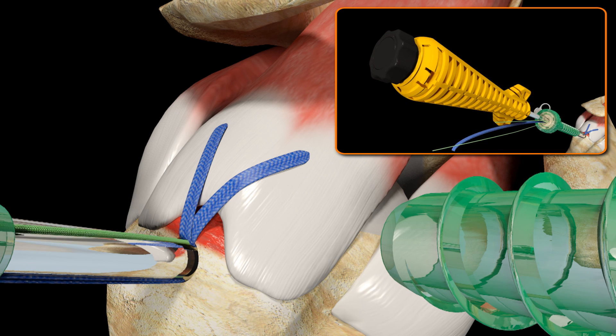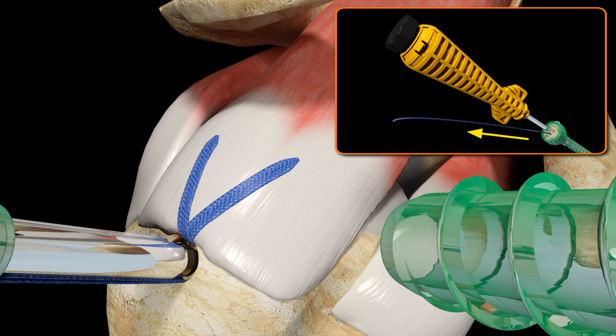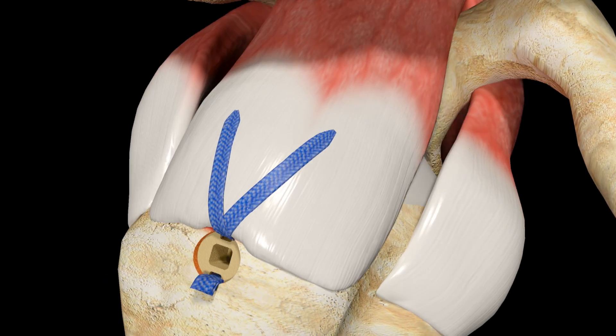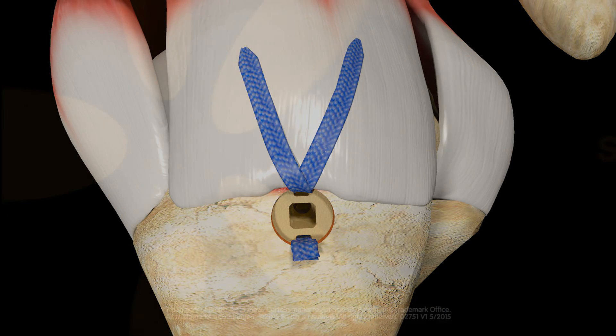Release the green stay suture from the inserter cleats and slide them out of the Footprint Ultra PK Suture Anchor and discard. Maintain light downward pressure on the anchor inserter while individually tensioning the limbs of Ultra Tape Suture through the Footprint Ultra PK Suture Anchor until desired repair tension is achieved. While keeping light downward pressure on the inserter, rotate the inserter knob clockwise to deploy the interlocking screw. Rotate until a loud click can be heard, then rotate the inserter knob one quarter turn counter clockwise to allow for easier separation of the anchor from the inserter. Remove the inserter and using the Smith & Nephew Flush Suture Cutter, trim the excess limbs of Ultra Tape Suture flush to the Footprint Ultra PK Suture anchor. The repair is now complete.